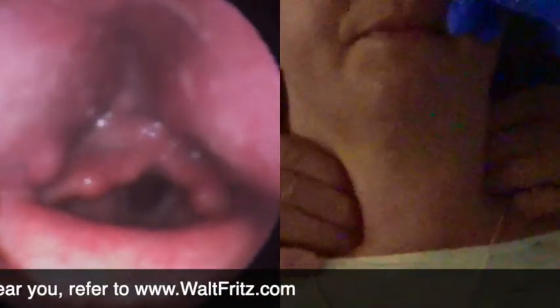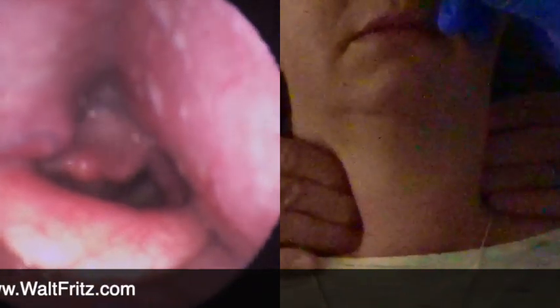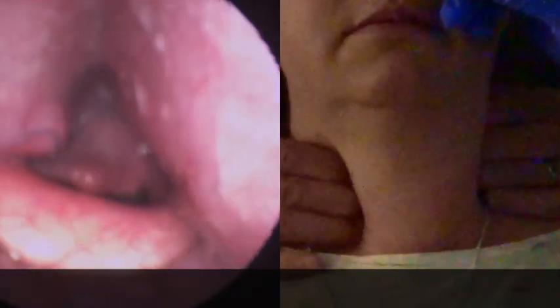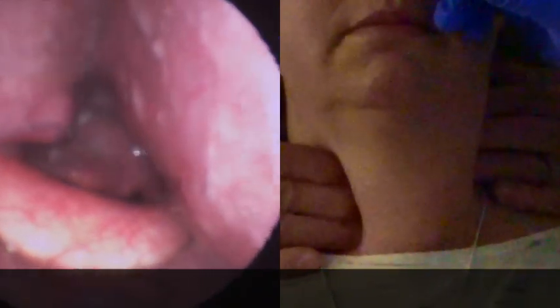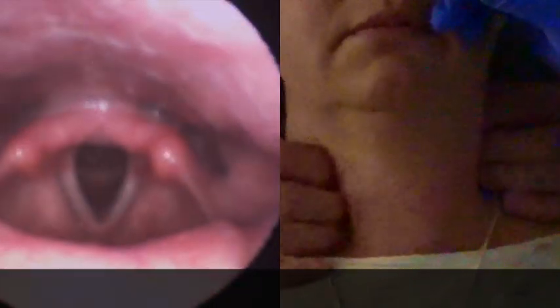I definitely could see how you could use the FEES as a before and after, right? In terms of seeing what's going on, doing some treatment, and then going back for a retest. I'm just thinking along the lines of what we saw in Buffalo. I told you about that yesterday, right? Is there a way to make these two part of both evaluation and treatment? I'm not quite sure. But now we've got a nice equal view.